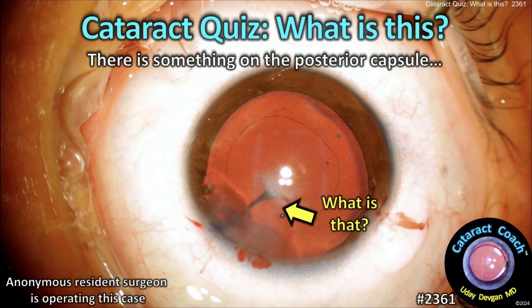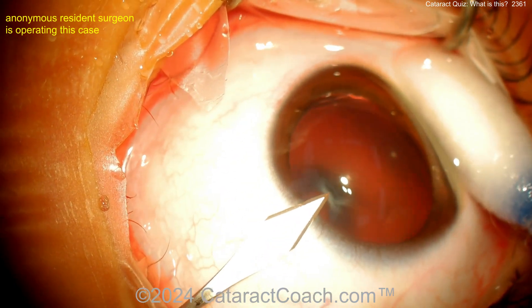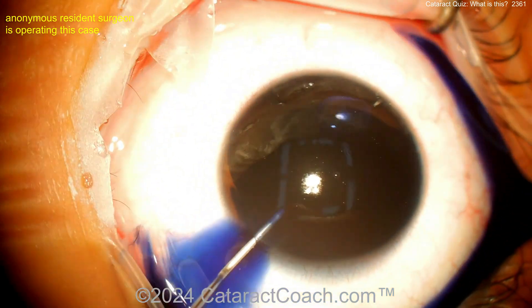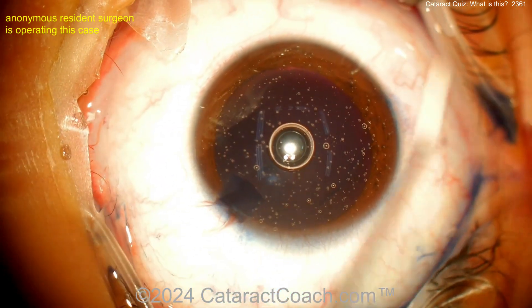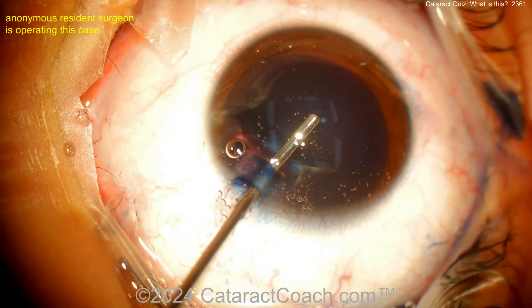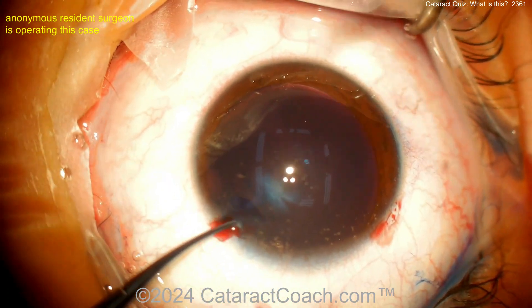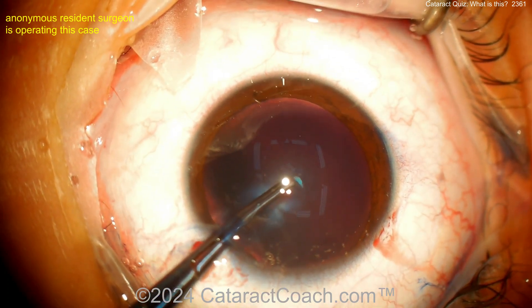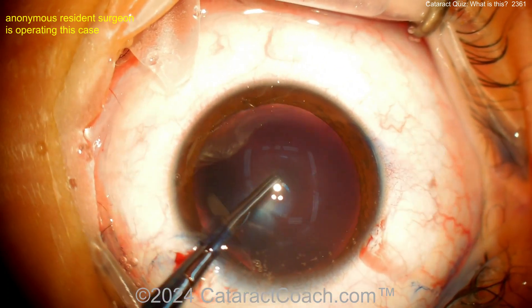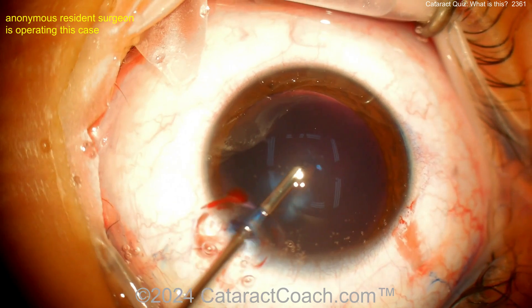cataractcoach.com cataract quiz — what is this? Look carefully, there's something on the posterior capsule. An anonymous resident is operating this case, and you can see something going on behind the posterior capsule. Putting some trypan blue dye in and washing that out — we've obviously sped the video up, we'll slow it down for the good parts. There's a big white opacity there behind the posterior capsule. What do you think that is?